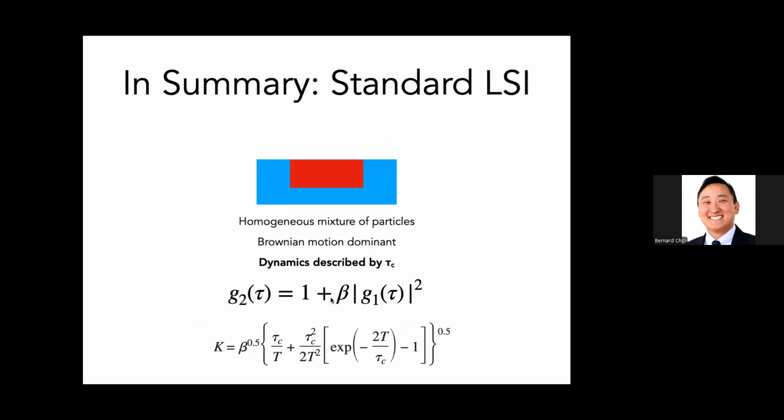We can basically model the process and look at the different momentum transfer events and tally it up to then get the G1 value, or G1 function, that way. So with standard LSI, the simplest version, in this case we have all dynamic scatterers, and it's a fairly simple equation that we can solve to map contrast onto flow.